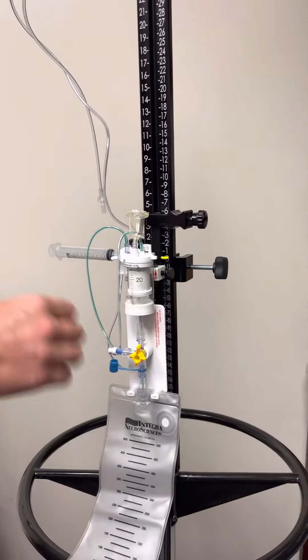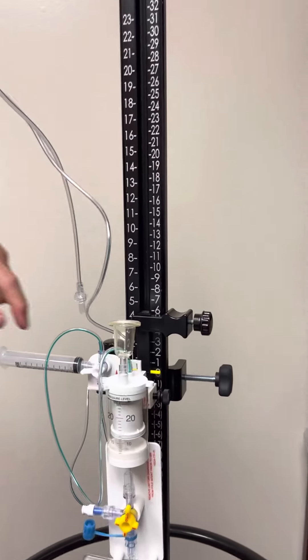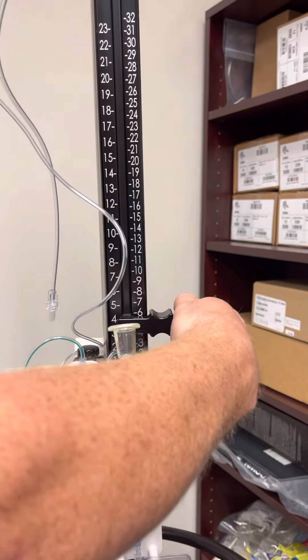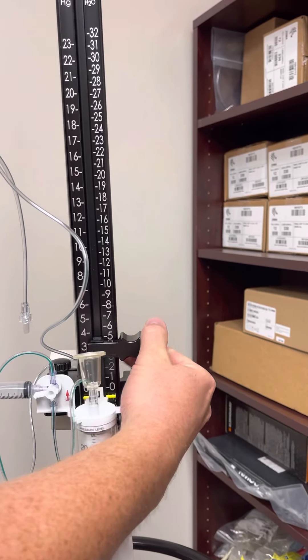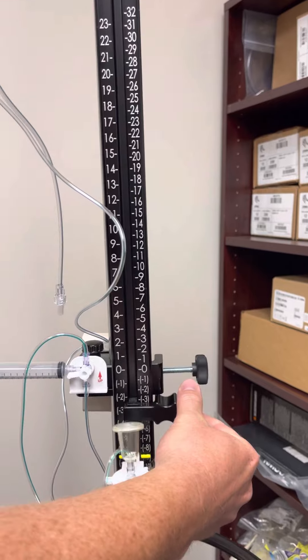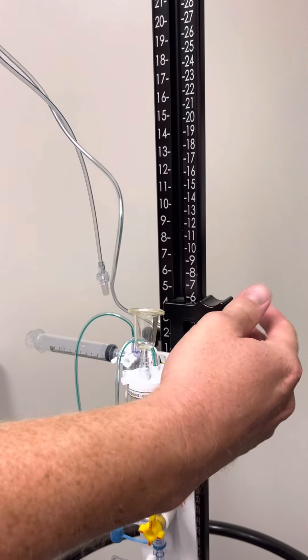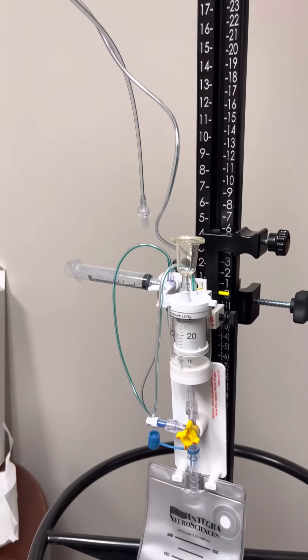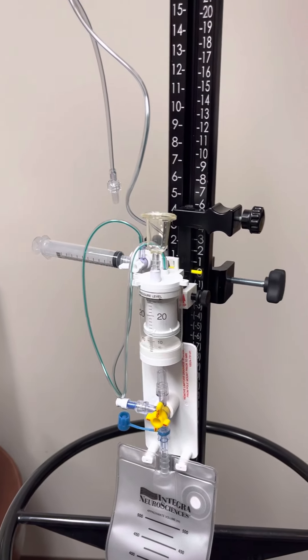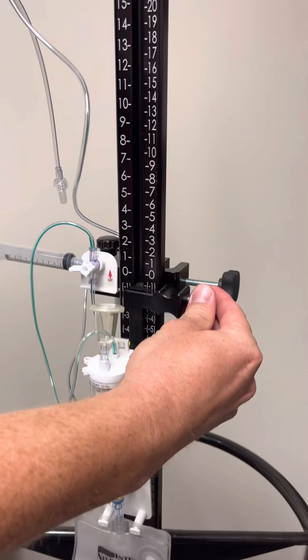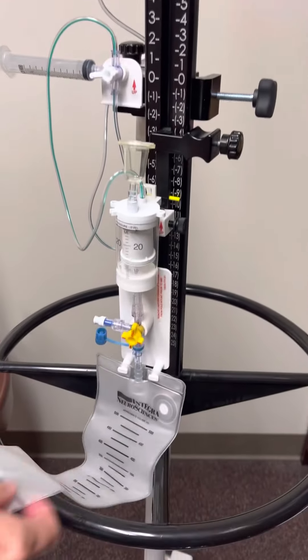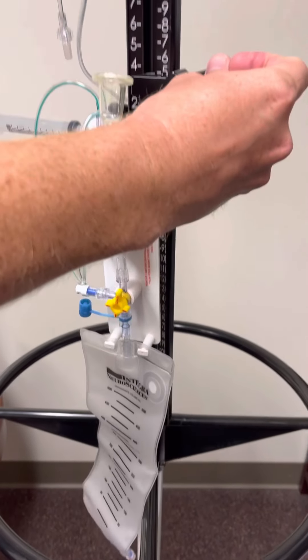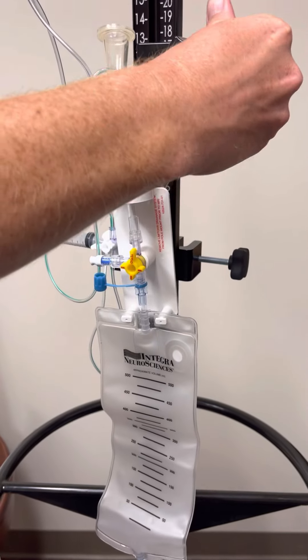The other thing about a lumbar drain, there's not necessarily a level of the drain ordered like our EVD or ICP monitor. This is more kind of patient preference or specific. Depending on if the drain is not draining enough output, then you would lower the device to get the desired or ordered output. Or if it's draining too fast and causing the patient to have a spinal headache, you could raise the device.